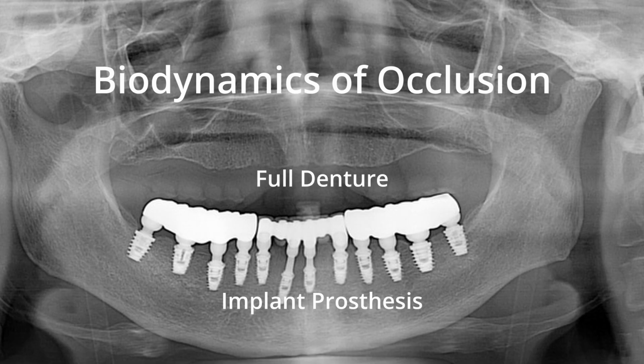Therefore, reducing overbite is necessary to minimize cantilever length. That is why eccentric guidance in AllonX is designed based on fully balanced occlusion. Even in cases with maxillary removable full dentures, occlusion is adjusted to a fully balanced scheme to ensure occlusal stability. Of course, in maximum intercuspation, stable contacts are achieved through interlocking holding cusps and uniform anterior tooth contact.